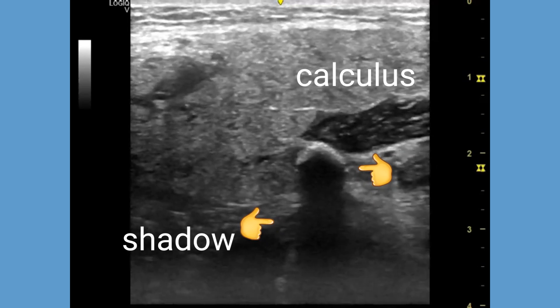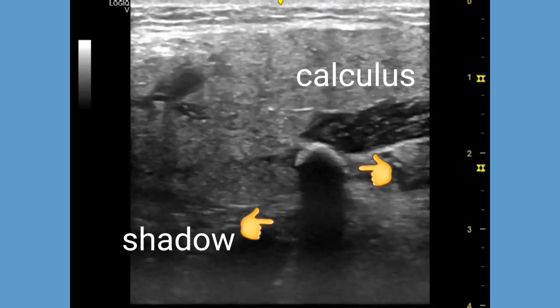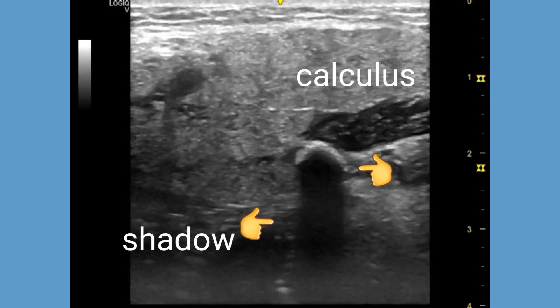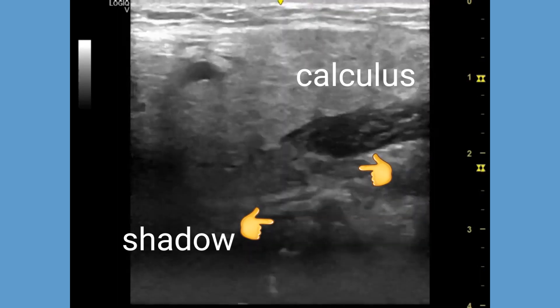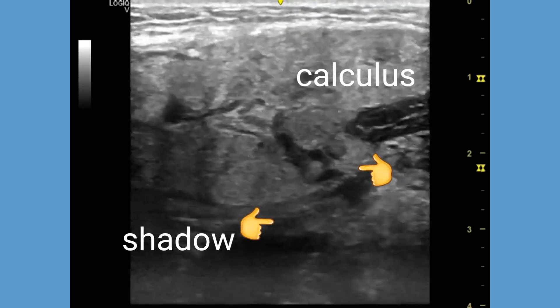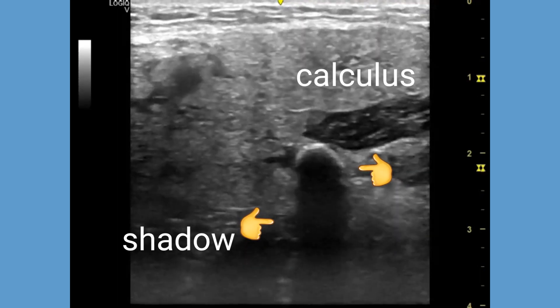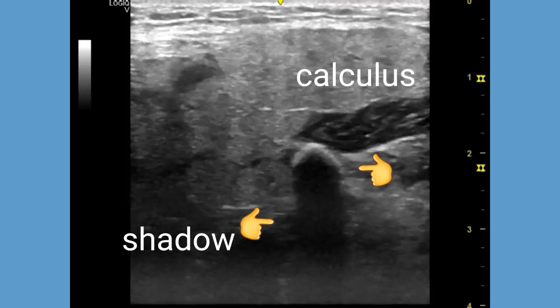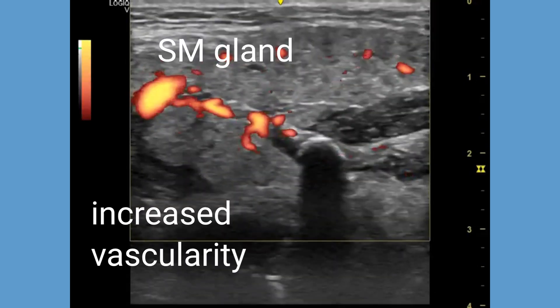The calculus appears as a bright echogenic area with a dark acoustic shadow posterior to it. This indicates the high density and acoustic impedance of the Wharton's duct calculus.